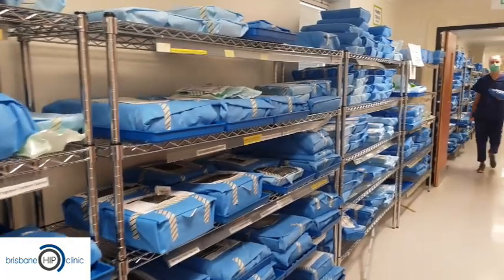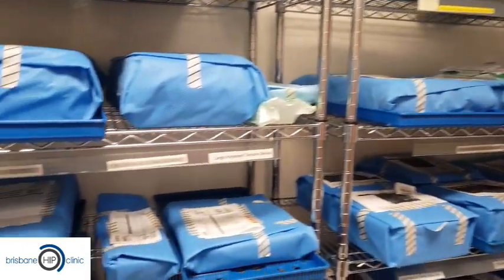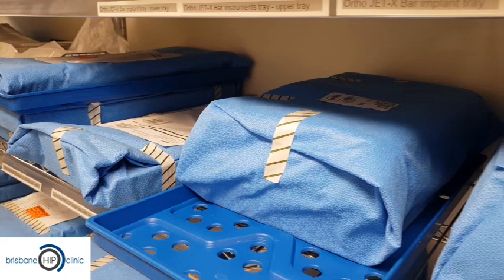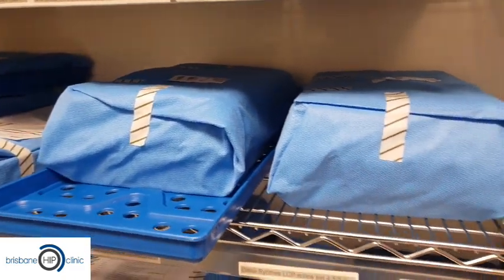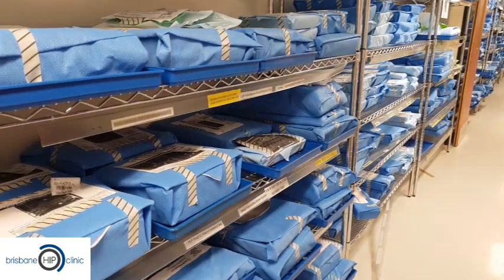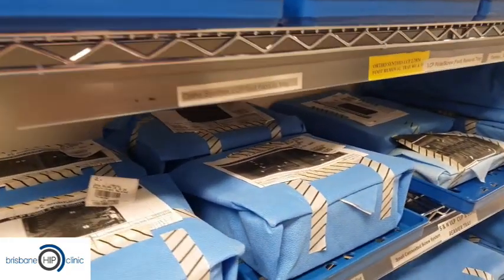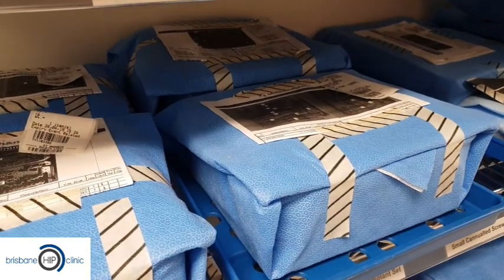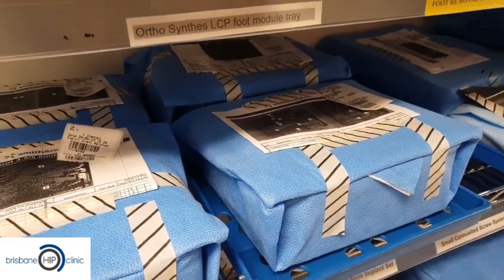These are all the trays that have been sterilised — you can see that they're all wrapped up in their sterile containers. We open them up at the time of surgery and they remain sterilised. There are little markers inside them and the tape assists us in knowing which ones have been sterilised correctly.